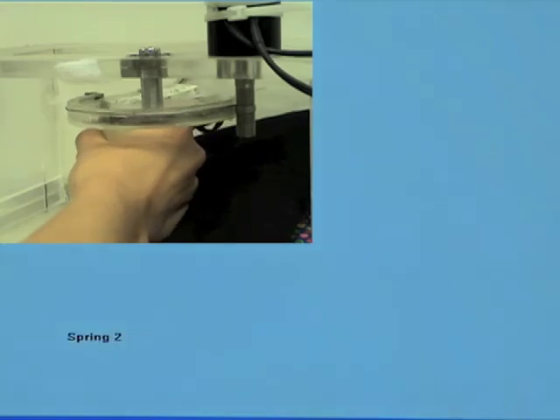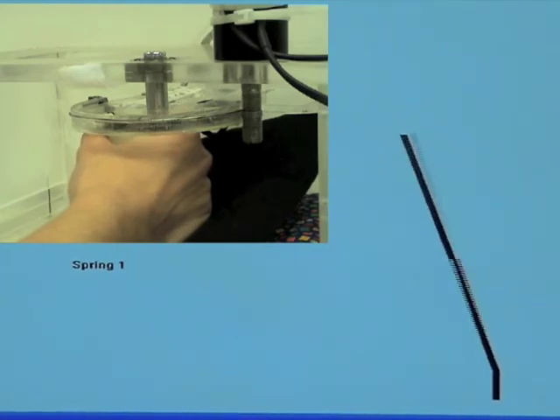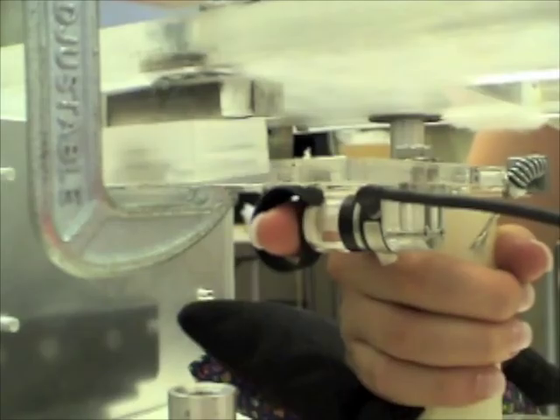In the proprioceptive motion condition, the person proprioceptively senses the real finger moving, yet visually perceives no motion information since the virtual finger is not displayed on the computer screen. This condition is analogous to real limb use in which sight is not available, such as when the lights are turned off in a room. In the visual motion condition, the person visually sees the virtual finger rotating on a computer screen, yet proprioceptively does not sense her real finger moving. This condition is analogous to prosthesis use, in which the user's effort controls the motion of the artificial limb, and the limb's location in space is relayed by sight only.